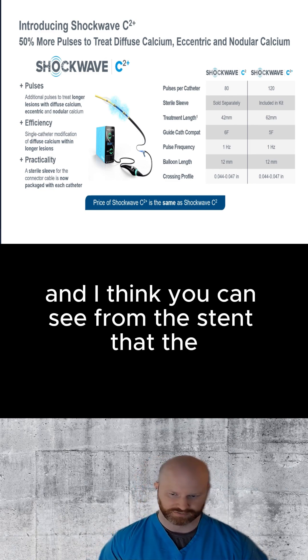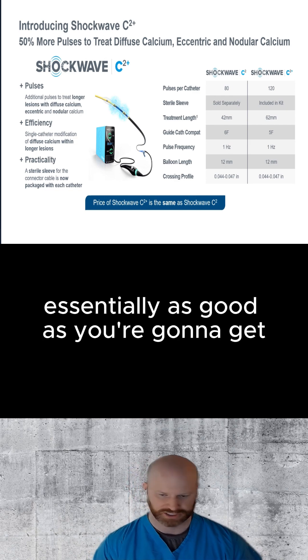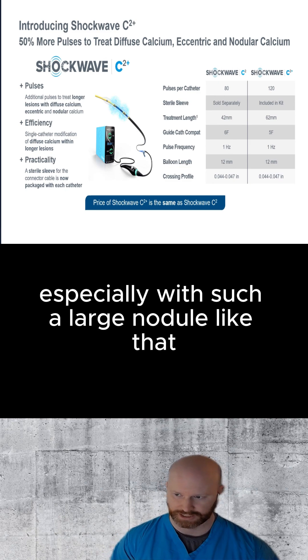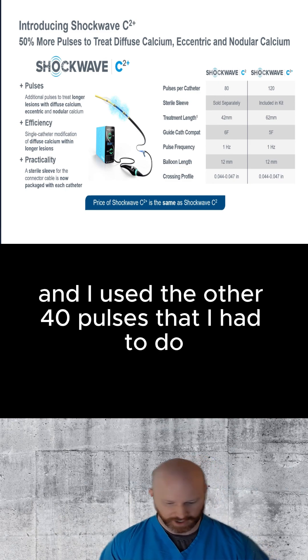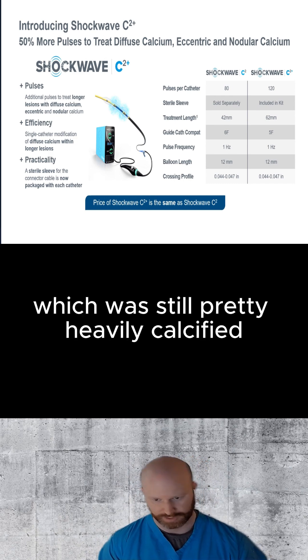And I think you can see from the stent that the modification of the calcium was essentially as good as you're going to get. The stent expansion was as good as you're going to get, especially with such a large nodule like that. And I used the other 40 pulses to do the rest of that LAD and get that expanded, which was still pretty heavily calcified.